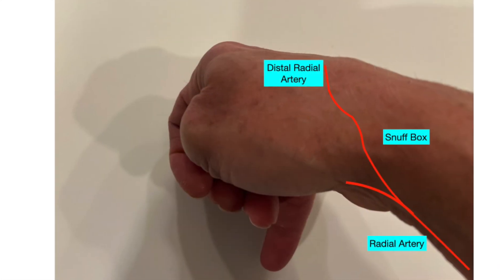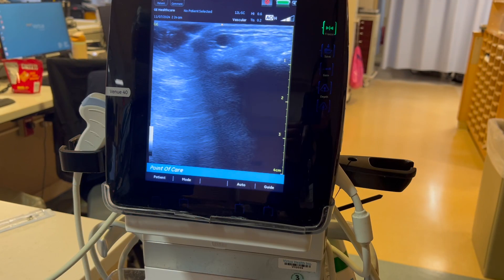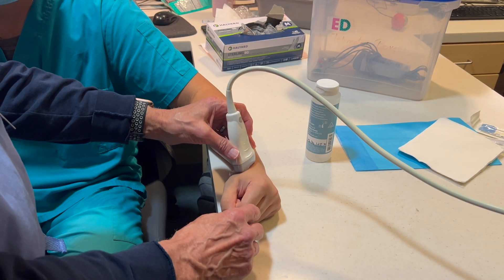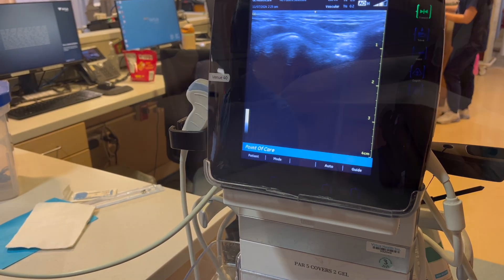To actually use it, you need to flex the wrist and then use an ultrasound to get into the artery itself. It's pretty big. If you like doing things in the transverse direction, this is what the artery would look like. But I tend to prefer to do things more in the longitudinal frame, and this is what the artery looks like there. And if you look carefully, you'll even see it pulsing there.